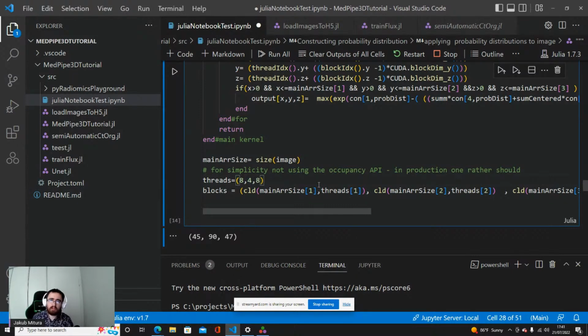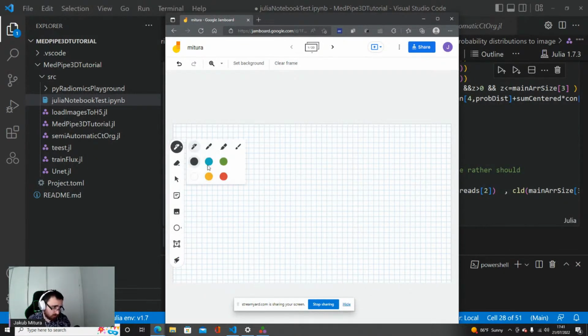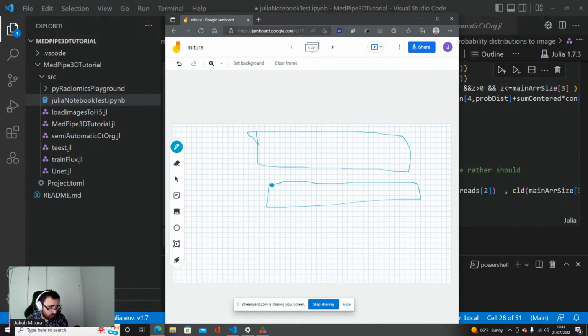And just for others who may not remember memory coalescence, this is a huge topic, and one of the most important to get the most out of the GPU. Basically, for the GPU, one of the most important things is when you load the data and how you load the data, because the threads in the GPU are not working on their own.